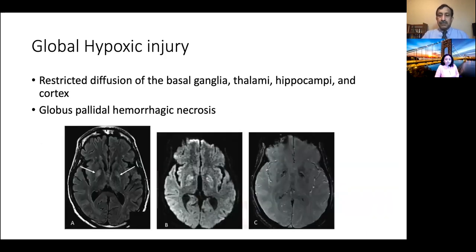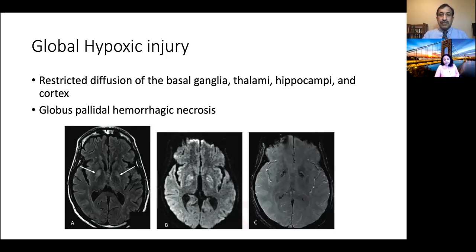Global hypoxic injury was also not uncommonly seen, as many of these patients were intubated because of lung issues — COVID pneumonia — resulting in hypoxic damage to the brain. In addition to the commonly expected findings of hypoxia, such as restricted diffusion of the basal ganglia, thalamus, hippocampi, and cortex, we also saw a few cases of globus pallidus hemorrhagic necrosis, with susceptibility in the globus pallidi bilaterally, restricted diffusion, and FLAIR hyperintensity — unusual but described previously with global hypoxia.